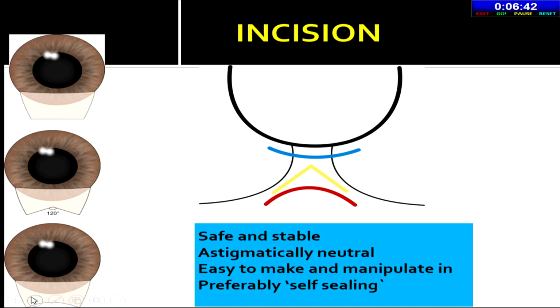technique you're using. If you're using a technique where your entire nucleus is brought out, obviously your external incision has to be larger. If you're using a technique where your nucleus is going to be broken either inside the anterior chamber or in the tunnel itself, then your external incision can be smaller. But a lot of surgeons are claiming that they can do it in 2 millimeter, 3 millimeter, but advisable would be at least 4.5 if you're doing a Phaco fracture, minimum I'm talking about.